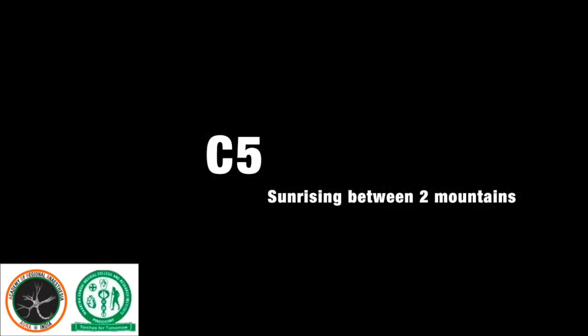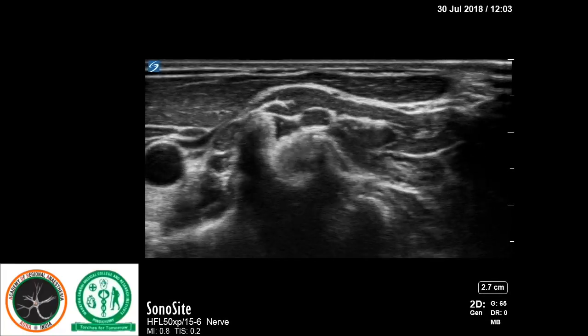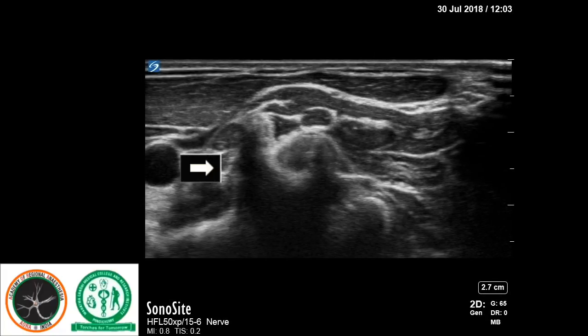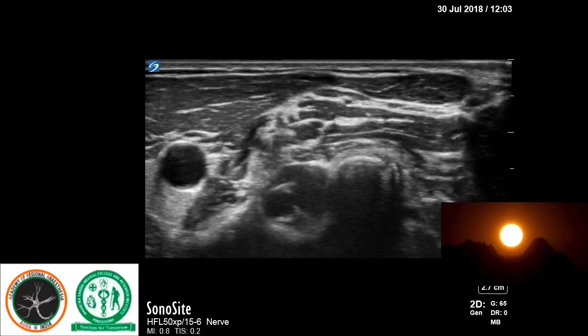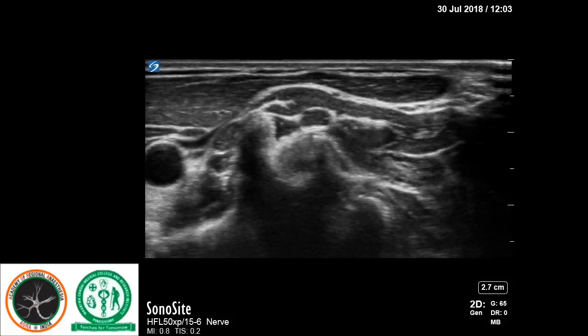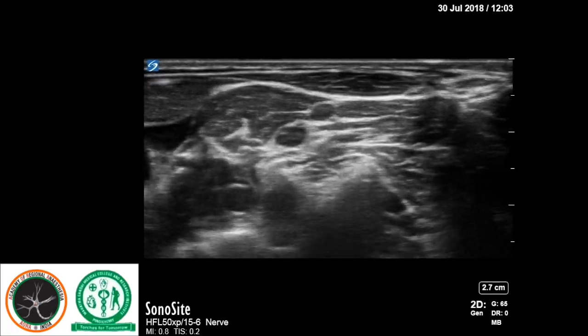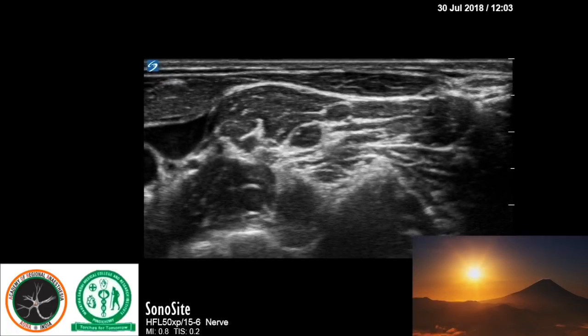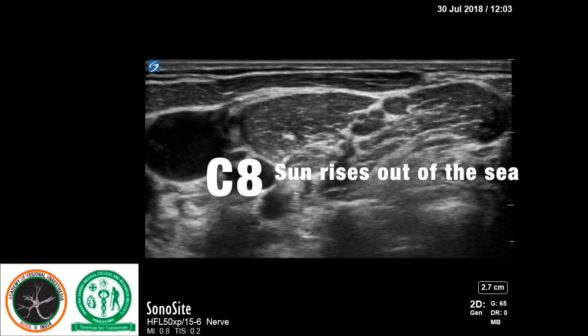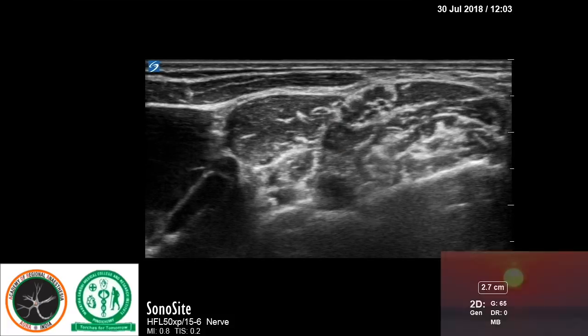Starting with C5, it appears to be rising out of two mountains, representing the bifid transverse process. At C6, it rises out of two mountains as well, but the difference between C6 and C5 is that there is a prominent anterior tubercle at the level of C6. At C7, it appears as if the root is rising out of a single mountain, representing the presence of only the posterior tubercle. The C8 appears to be rising out of a C-shape, because it is the rib and not the transverse process.